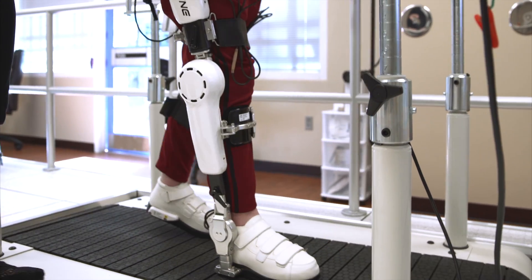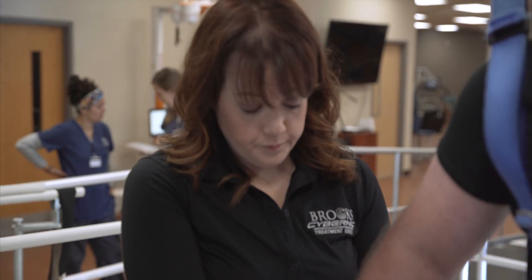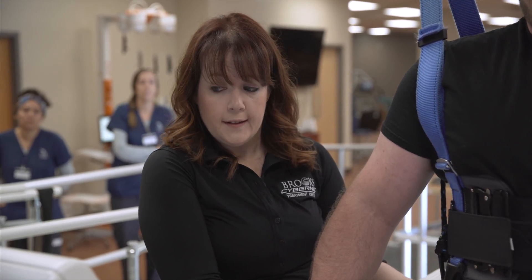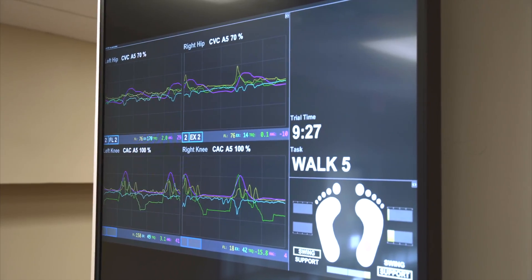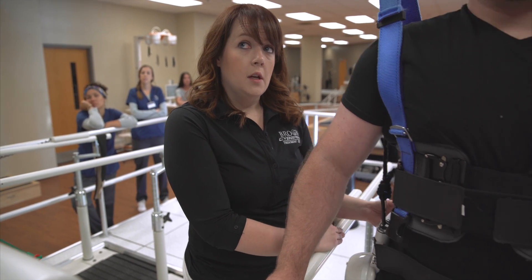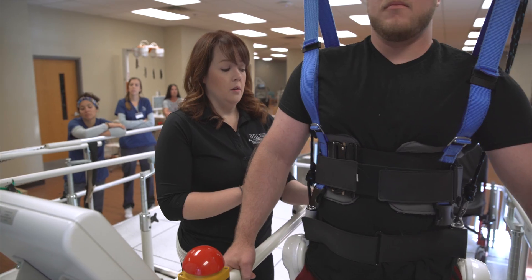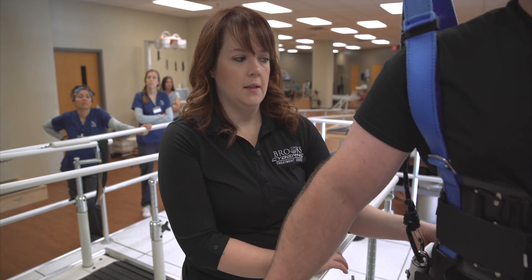The knees are relying on signals from the hips and are in a more automatic mode. We've been working on getting Maverick's hips really well trained as far as the signals go, to be able to do what they need to do when they need to do it, and his knees are what we're moving down to and targeting. Right now we're at 0.6 miles per hour. I'm also looking at not just his stepping but the signals on screen — it tells me where the timing is with each movement on each joint during the walking cycle, so I can adjust the controls to make it more natural or easier, or to emphasize whether he needs to flex his hip more or less.